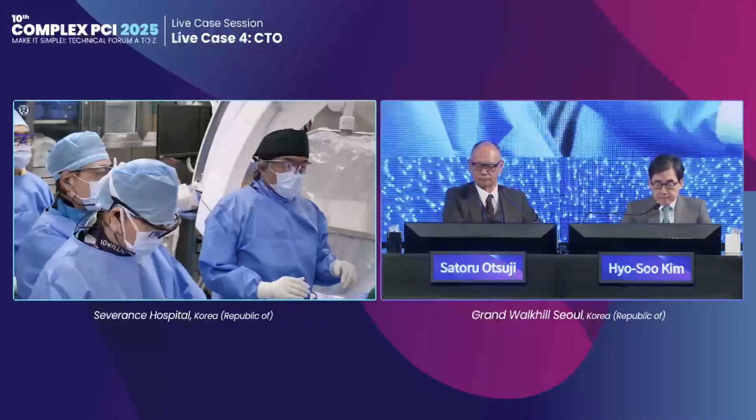Dr. Kim, can you hear me? Yes, please explain your case.